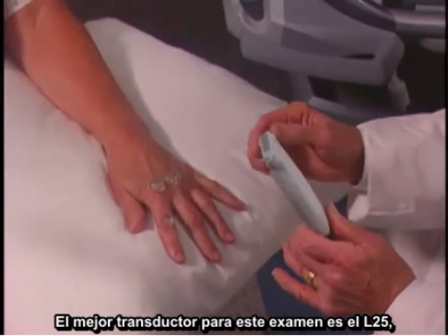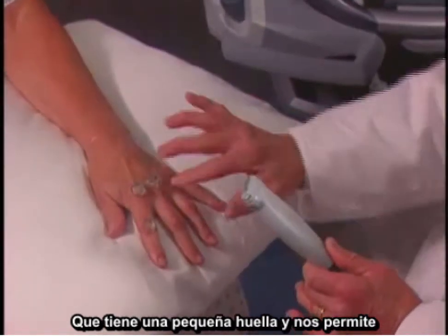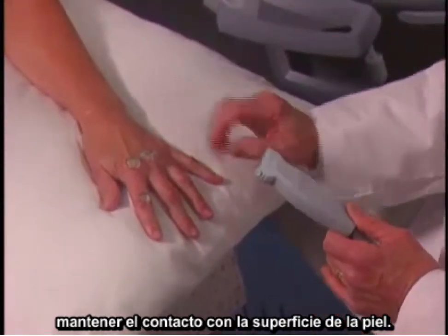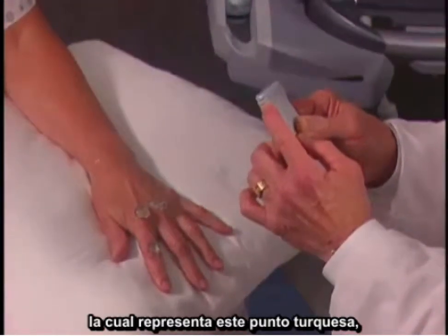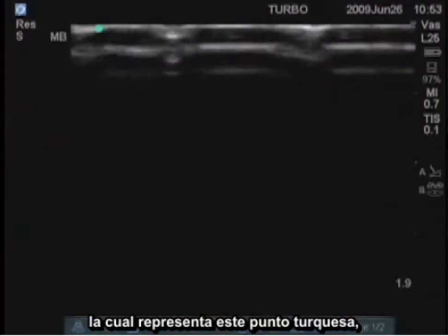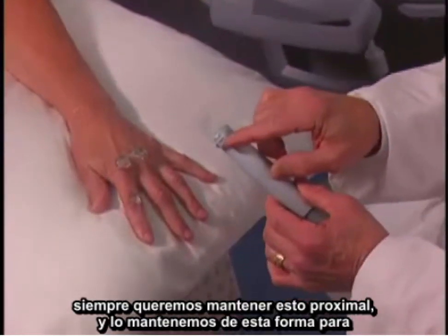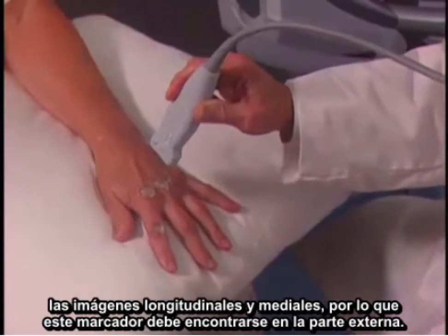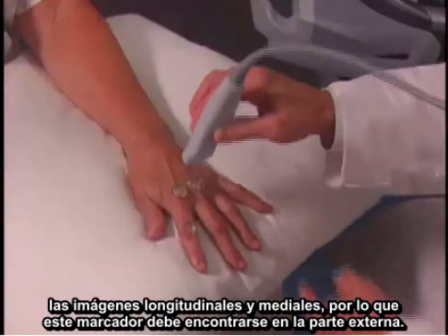The best transducer for this exam is the L25, which has a small footprint and allows you to retain contact with the skin surface. There is a marker on the transducer which represents this turquoise dot. To keep your orientation straight, you always want to keep this proximal for longitudinal images, and medial, so this marker should be on the outside.